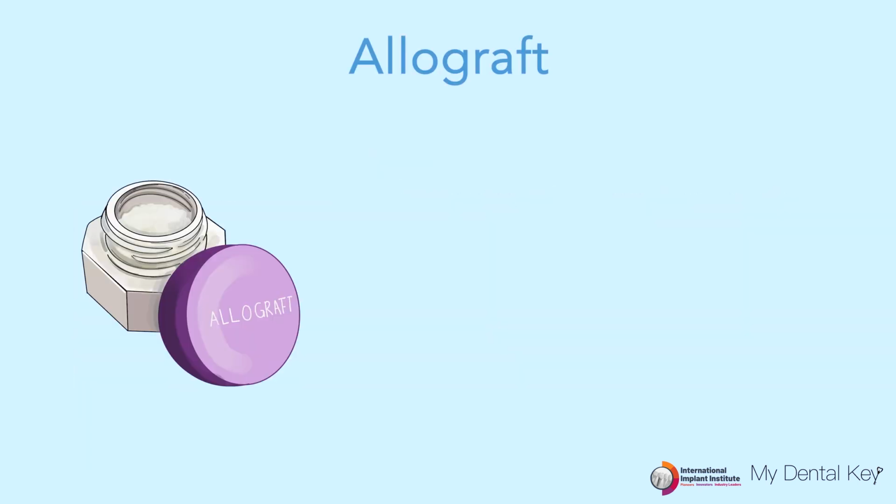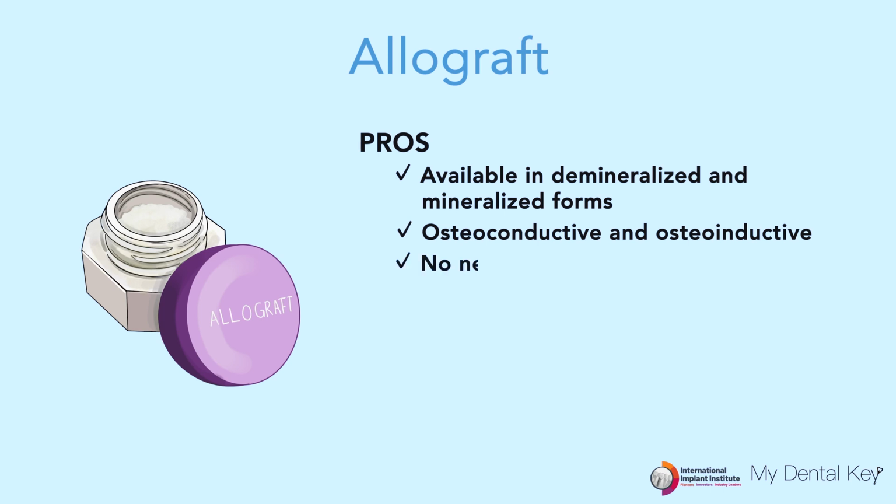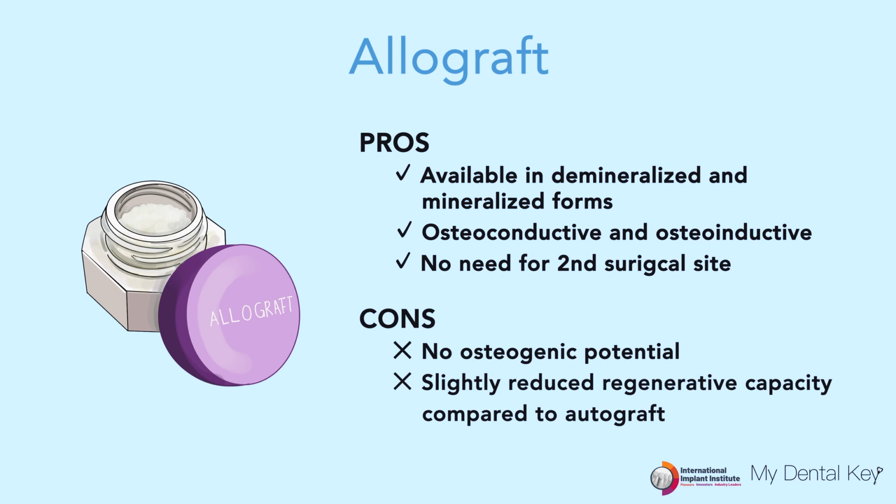Allografts are sourced from the human bone and are usually obtained from cadavers. They are available in demineralized or mineralized forms. They primarily promote osteoconduction, but also exhibit some osteoinduction. Allografts are widely used because of both their availability and compatibility. They are processed using ethanol to remove the soft tissue and cells and then sterilized using gamma irradiation. This process eliminates the material's antigenic properties, reducing the risk of immunogenicity. The sterilization process also affects the biologic properties of the graft and limits its osteogenic potential.